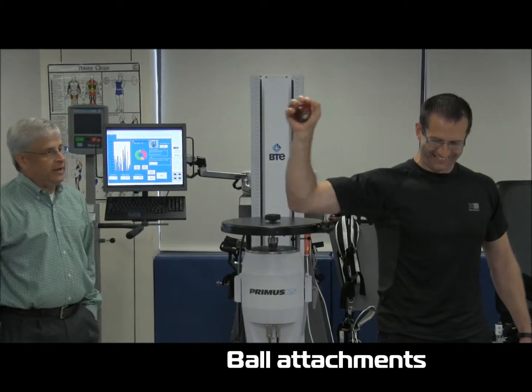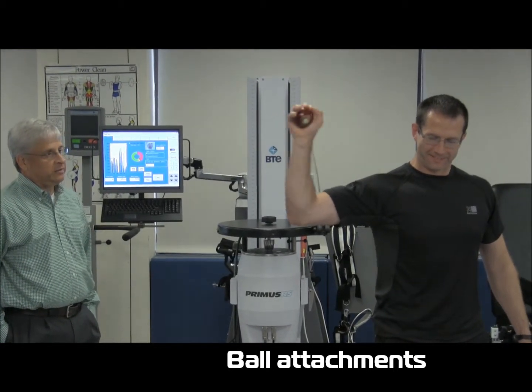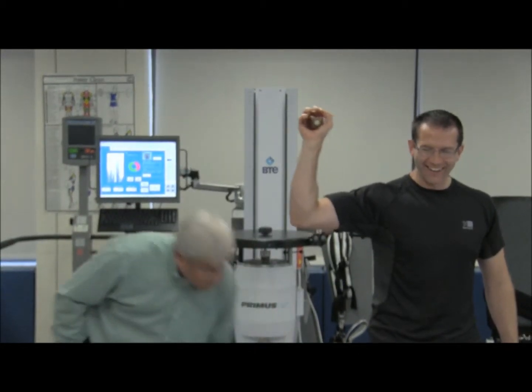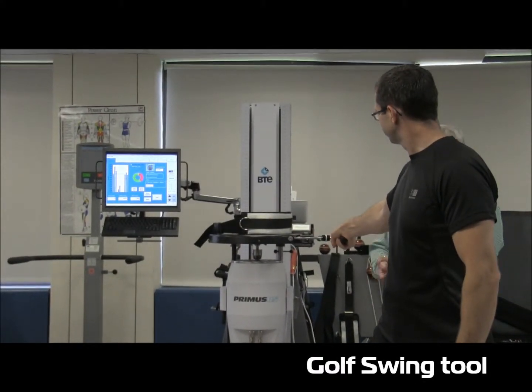So that's 220 newtons — 22 kilos against three. It could be a workout. Let it go. It's all in here. It's actually very uncomfortable.